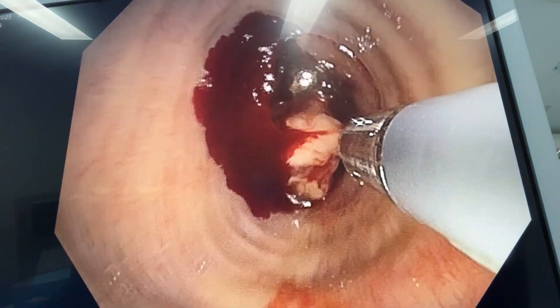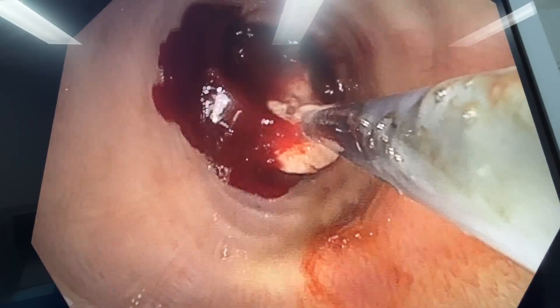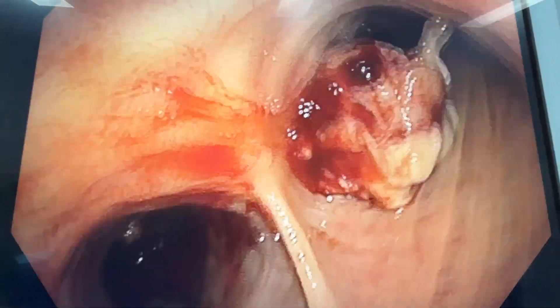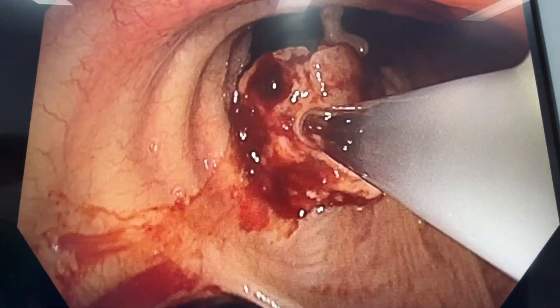I'll get the cryoprobe, because the cryoprobe will stick to that tumor and allow me to remove the resected section out through the rigid bronchoscope. So I can grab it — and oops, a little bit has fallen off. I've been able to remove a small amount, but I'll go back now and retrieve more of it. You can see it's fallen down the right main bronchus, so I can use the cryoprobe once again to use its freezing action to stick to that tissue and remove it through the rigid bronchoscope.